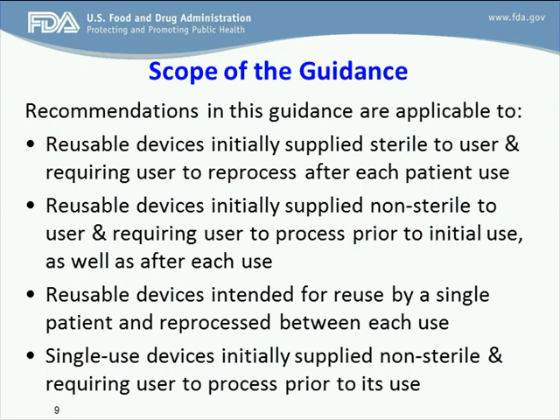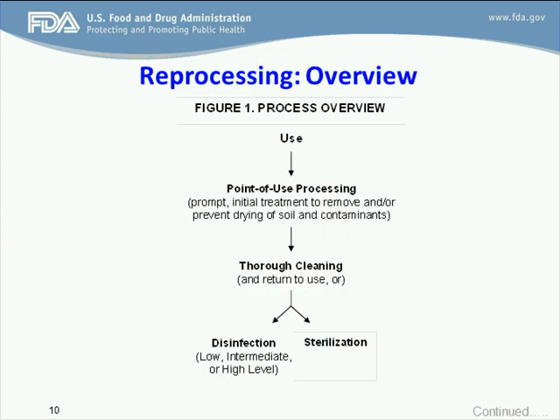Now I turn it over to Dr. Elaine Mayhall, who will walk you through the major topic areas covered in the guidance, starting with an overview of the various steps involved in reprocessing. Thank you, Geeta. Good afternoon. This is Elaine Mayhall. I'm a reviewer in the Infection Control Devices branch in ODE.